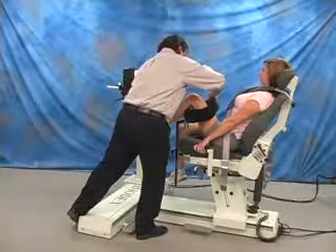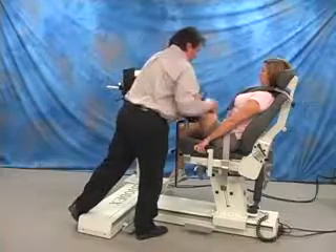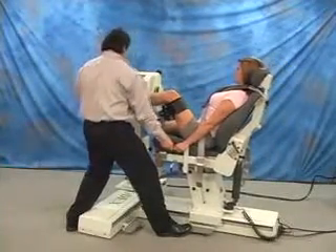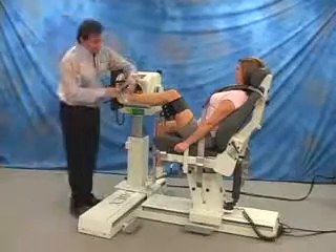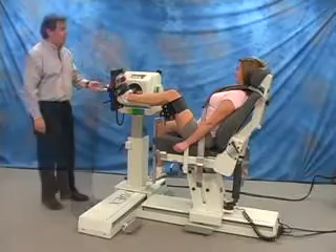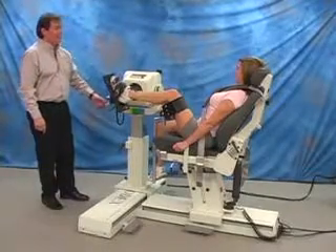Place pad under distal femur. Slide dynamometer into position and secure ankle to foot plate. Reset range of motion stops.